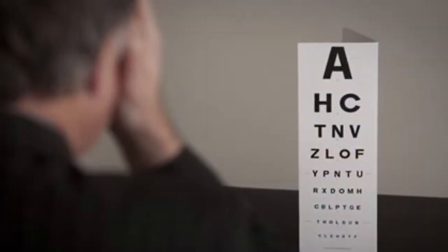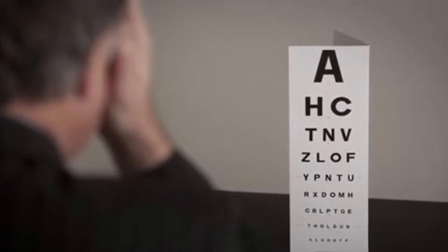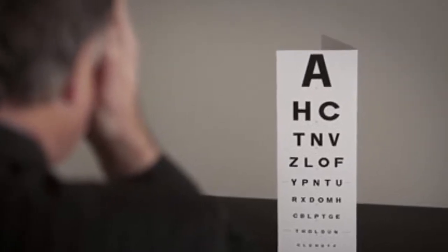To start the test, have your patient stand 20 feet away from the Snellen eye chart. If they are wearing a hat, have them remove it. If the person wears contacts or glasses, make sure they are wearing them for this exam. Have the patient cover one of their eyes and have them read the very bottom line of the chart from left to right.